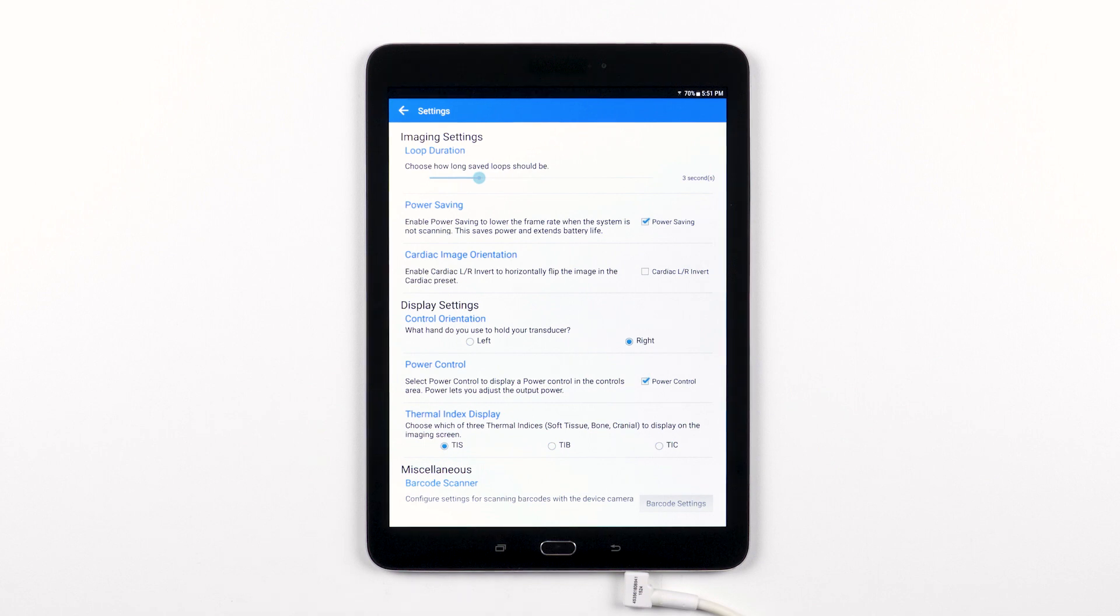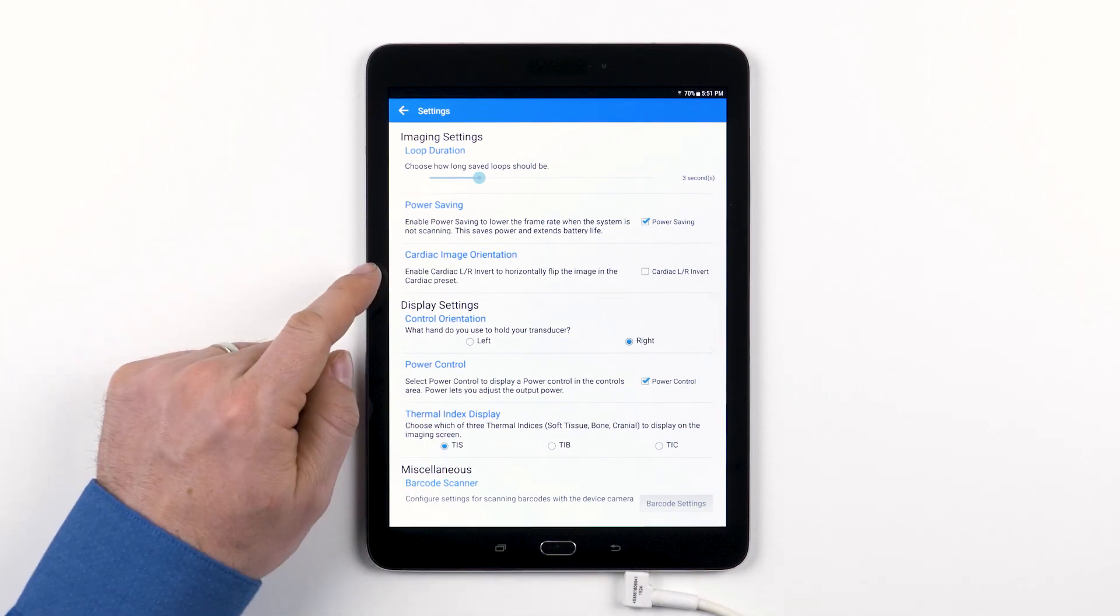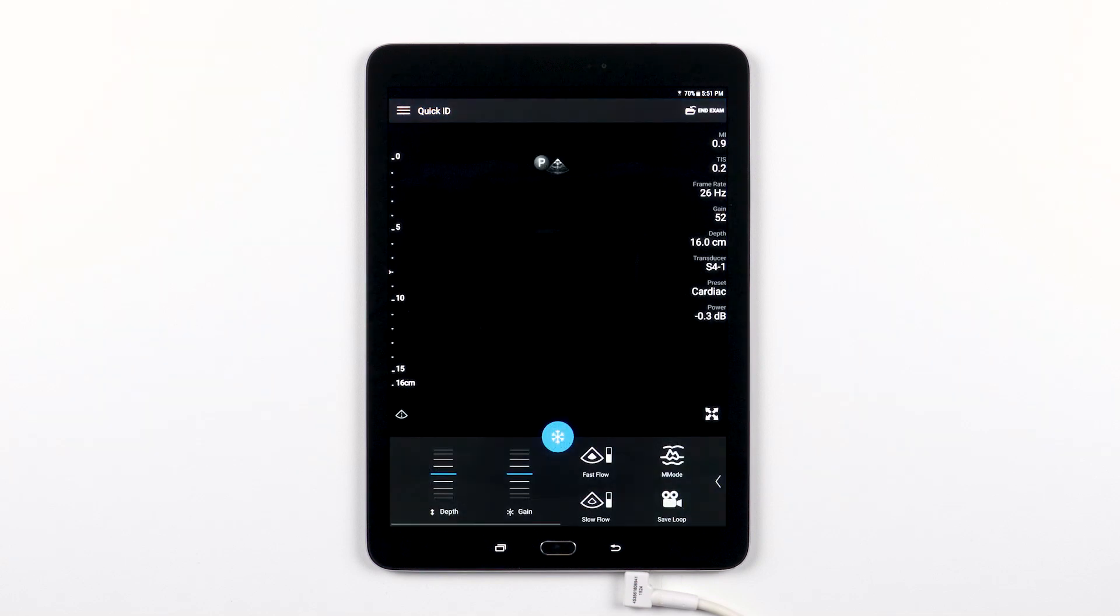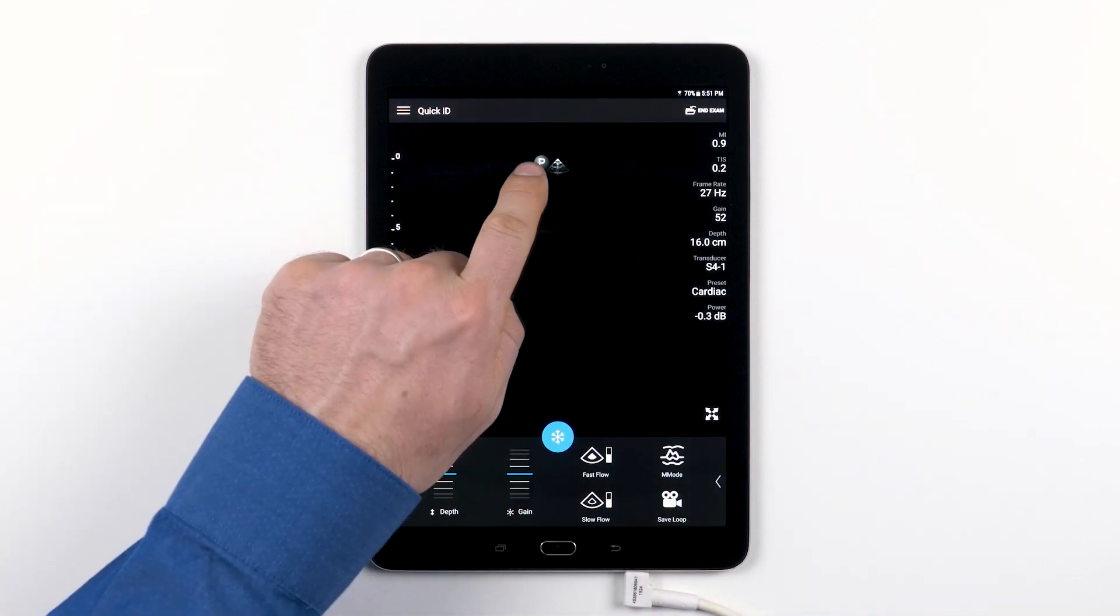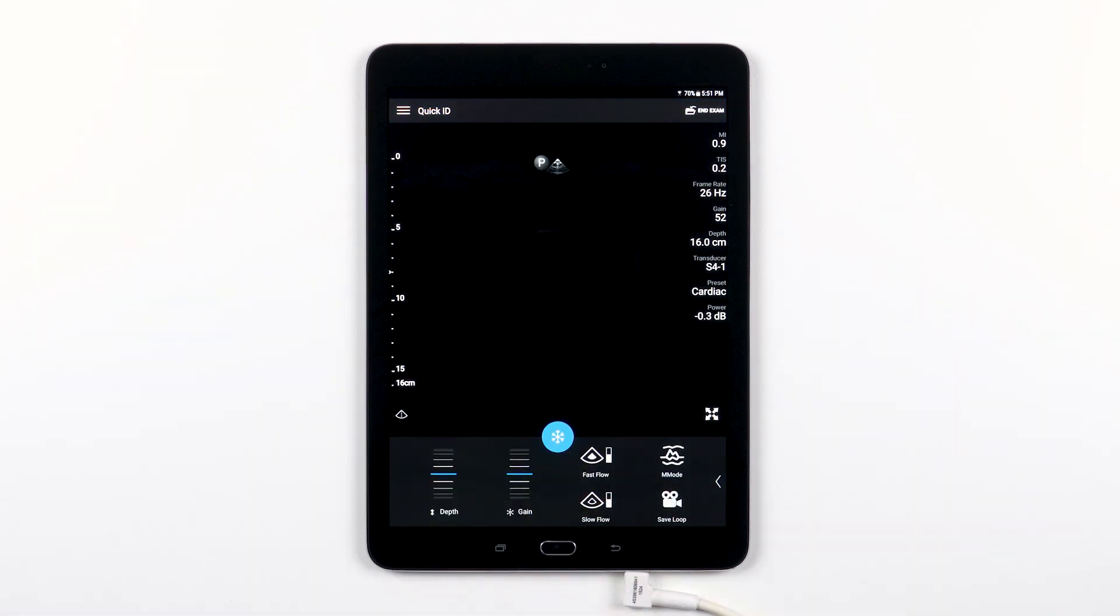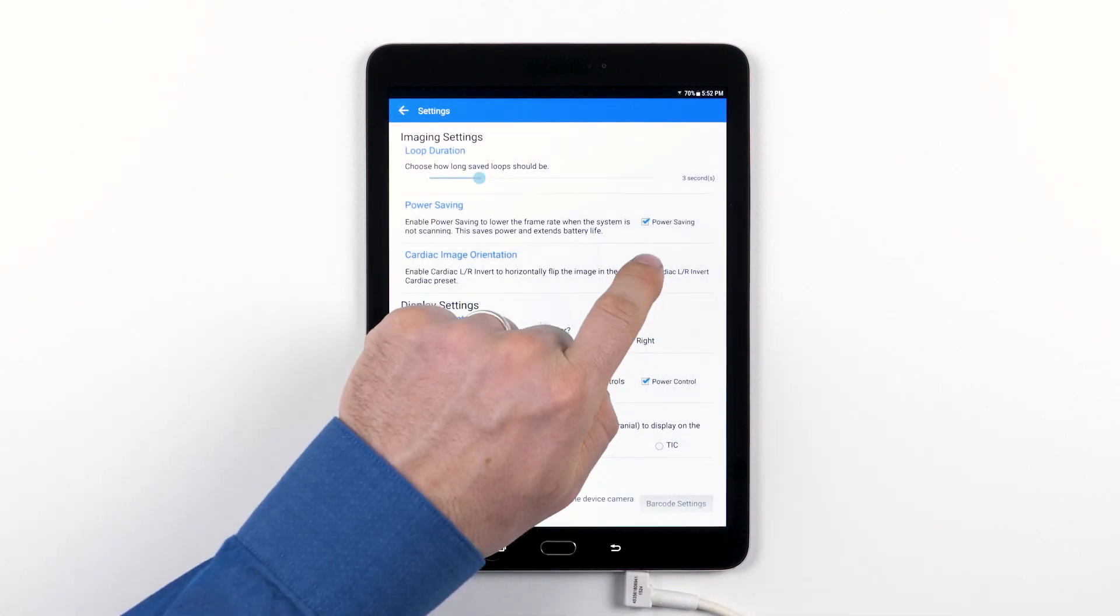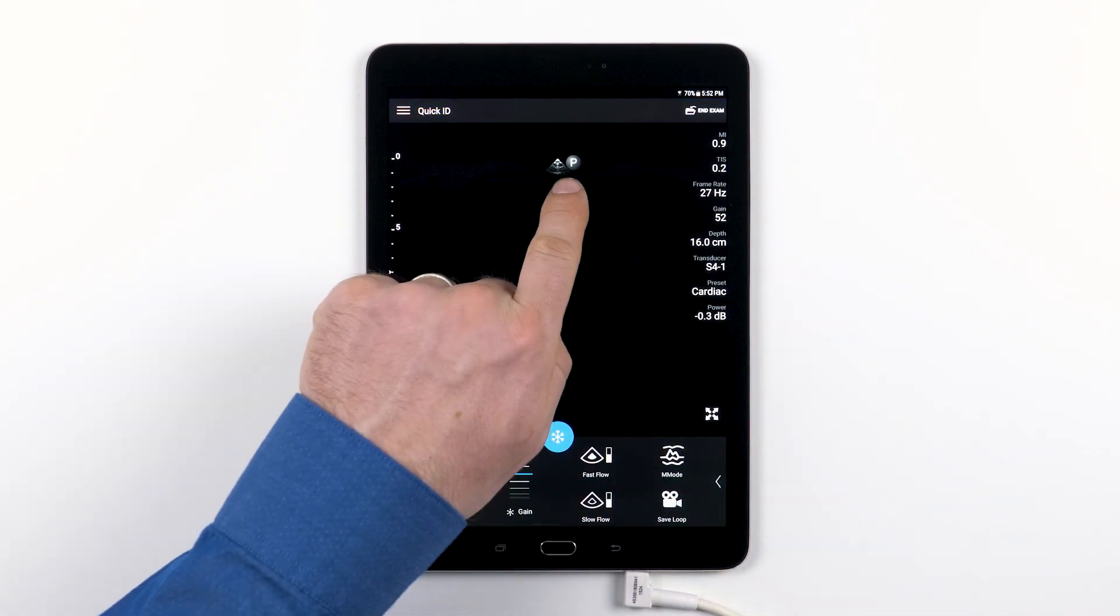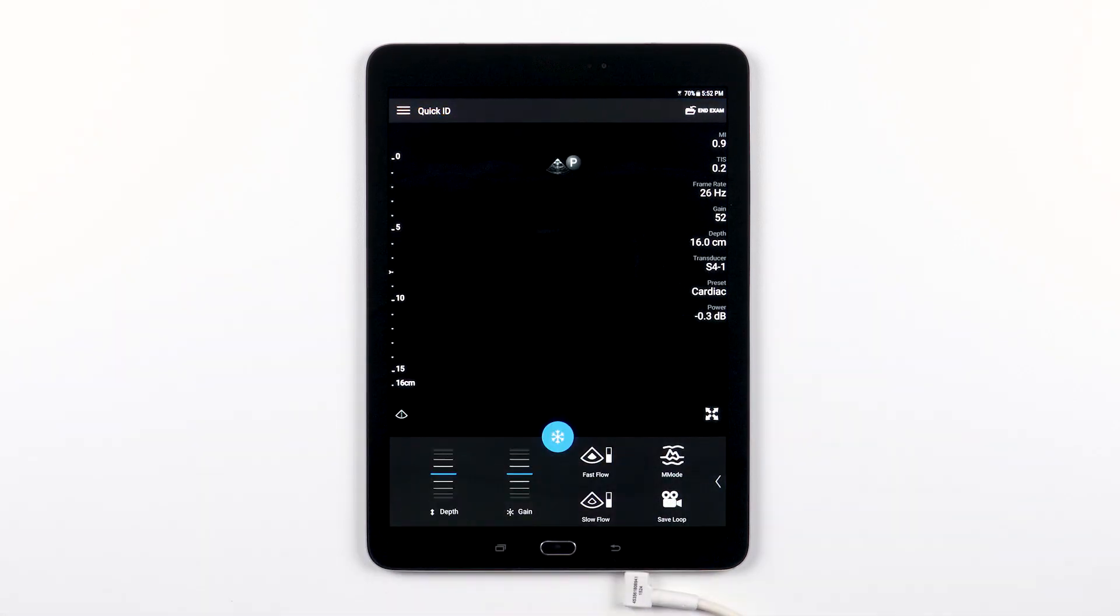The cardiac image orientation setting allows you to flip the orientation marker on the ultrasound image. By default, Lumify adopts the echocardiologist convention of image orientation. Unchecking this box reverses this orientation to the format that some point-of-care users prefer.